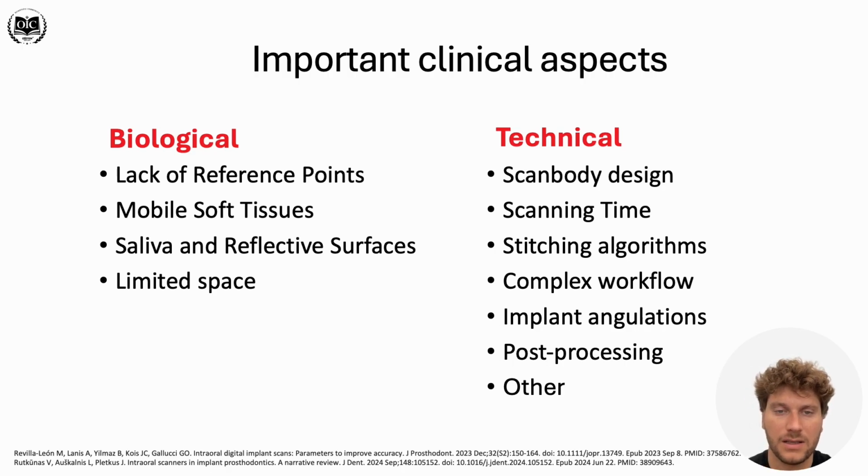And then there are technical aspects, and this is the whole lecture about these topics. This includes scan body design, scanning time, and the stitching algorithm that is behind the scenes, and this information is often not available to the dentist and researcher because it's owned by the companies that produce these scanning machines. Also, we have complex workflows that are sometimes hard to fulfill.